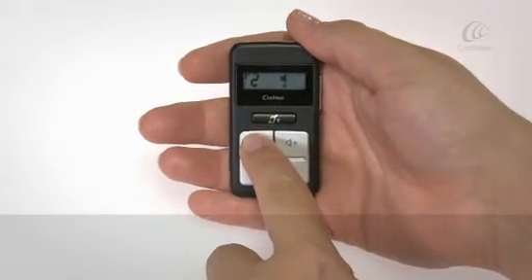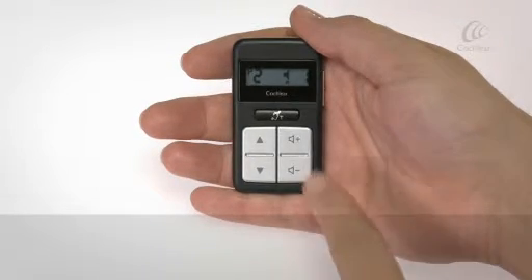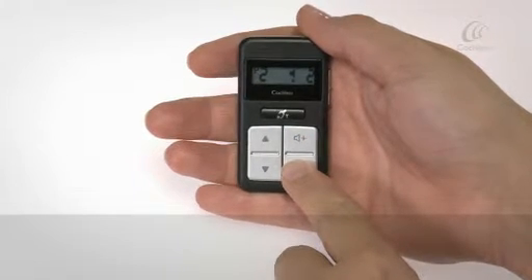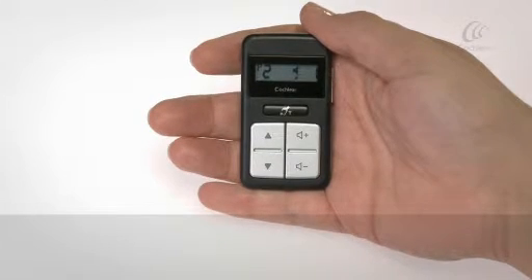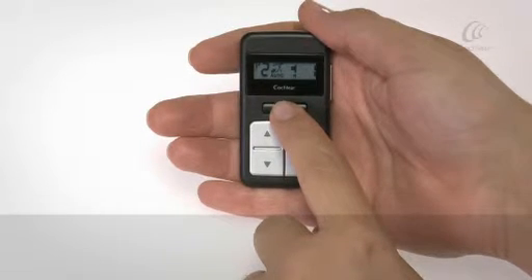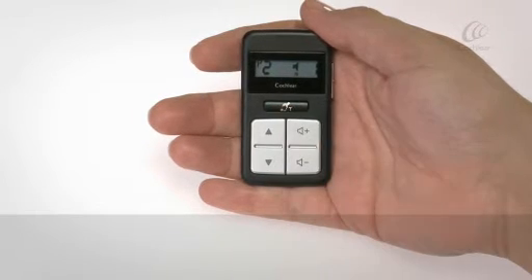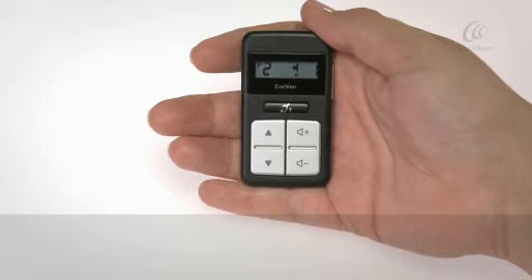The Remote Control allows you to change programs, turn your volume or sensitivity up and down, turn telecoil and auto telecoil on and off, and turn audio accessories on and off.